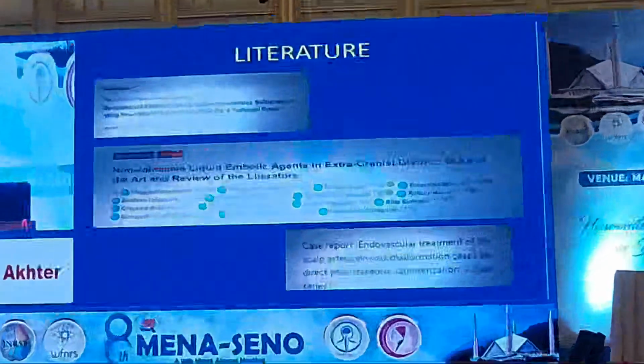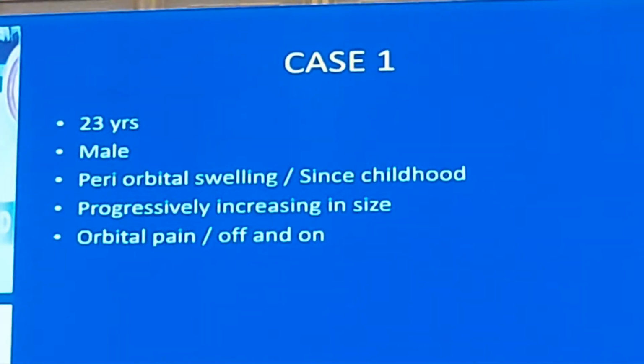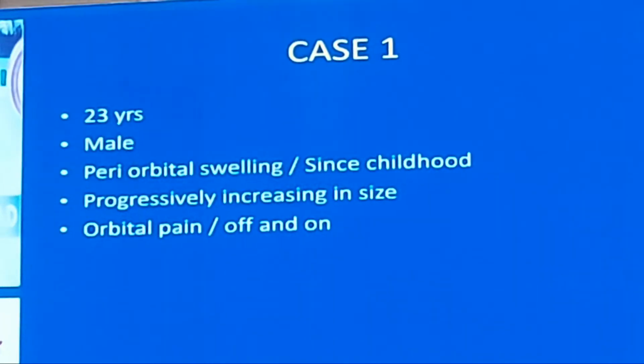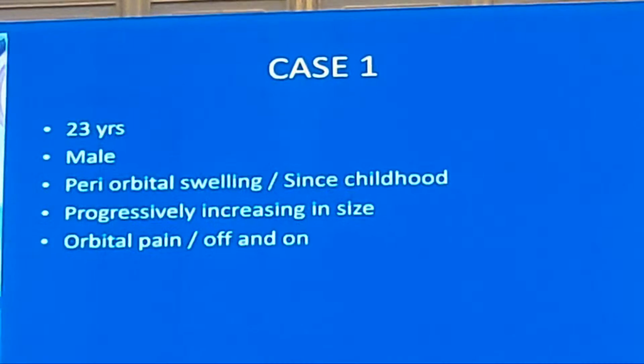And then we give liquid embolics. Coming to case 1, a 23-year-old male with periorbital swellings in childhood, progressively increasing in size, presented with orbital pain off and on.